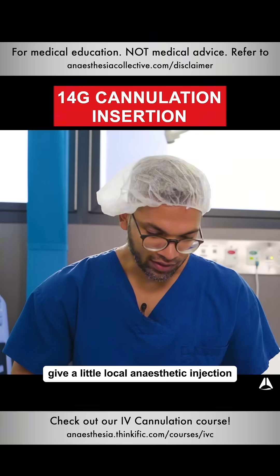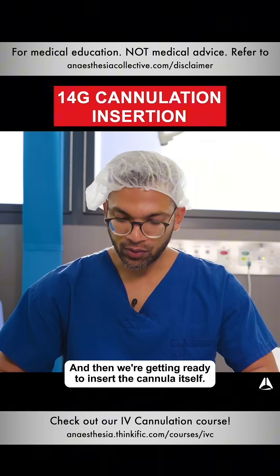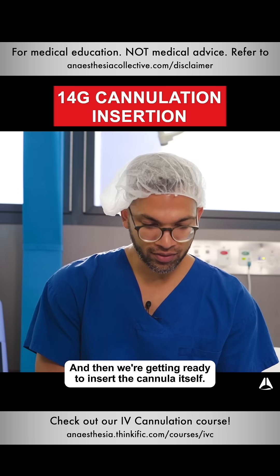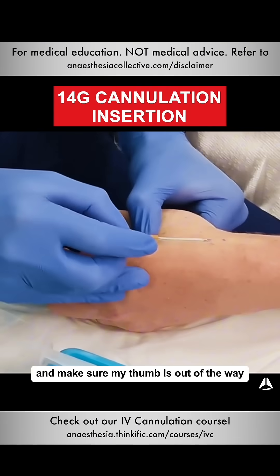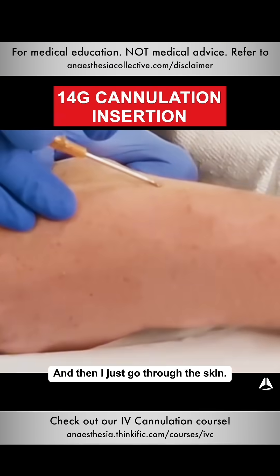The first thing I do is give a little local anesthetic injection at the appropriate site, and then we're getting ready to insert the cannula itself. I tense the skin and make sure my thumb is out of the way so I can get a nice low angle of insertion, and then I just go through the skin.